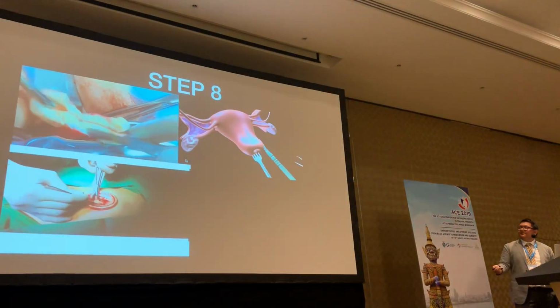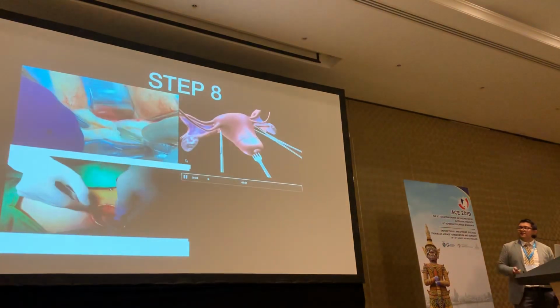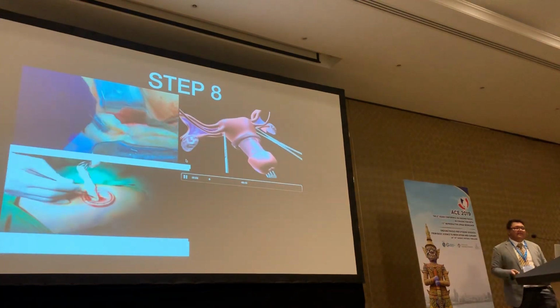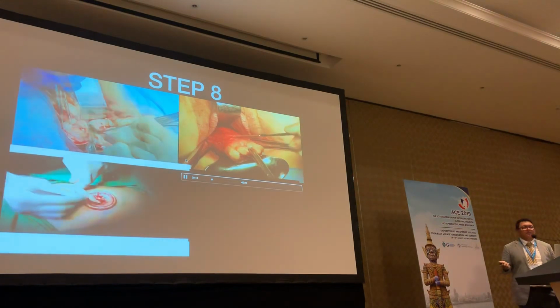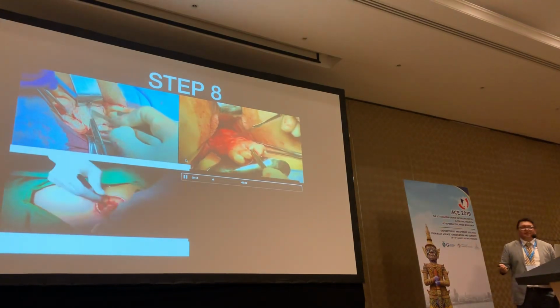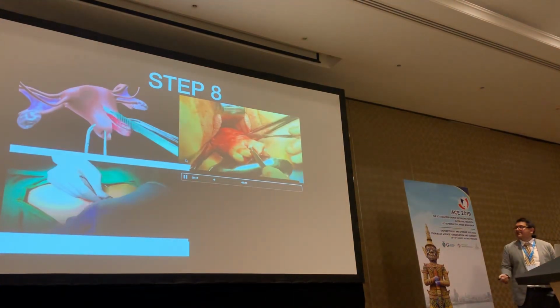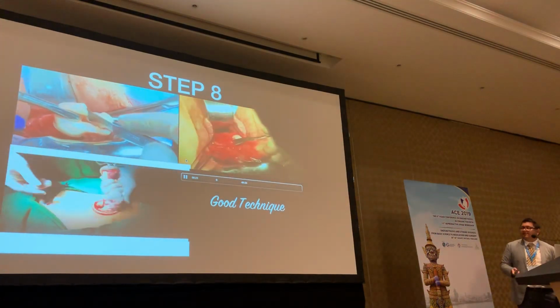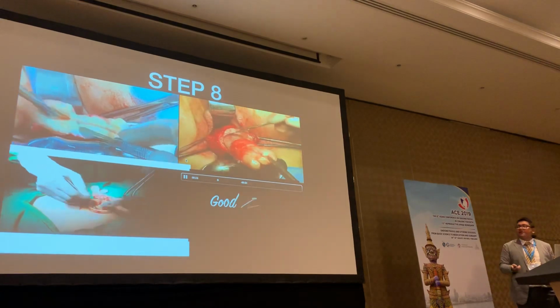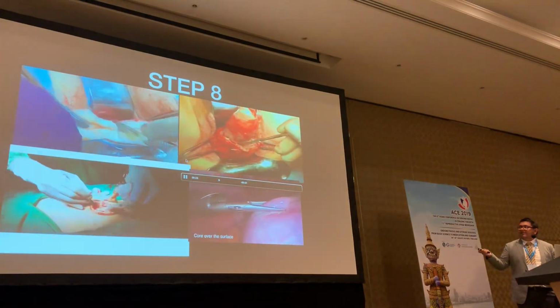And this is something I learned in Chang Gung during my fellowship, which is very invaluable for larger uteri and for fibroids. I don't power morcellate personally, preferentially. I have nothing against it. It's always a good thing to do if you know how to and if it's available to you, and some places you may not get a wound retractor. So there's no harm in morcellating.